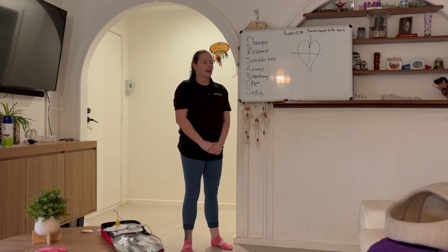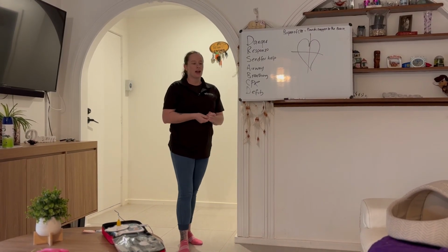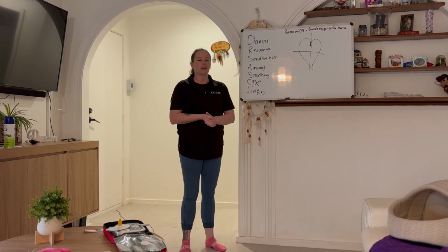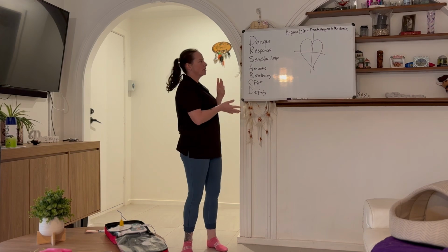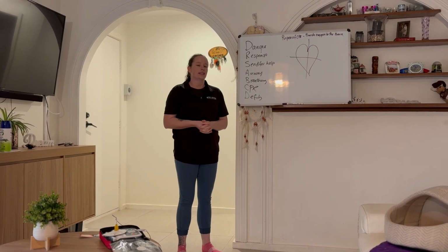Good afternoon, my name is Anna Marie and I'm your trainer for today. We're just going to go through the basic first aid and CPR. We're going to go over our fundamentals, which is our DRSABCD, and also the use of an AED.